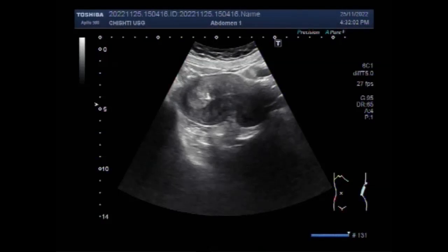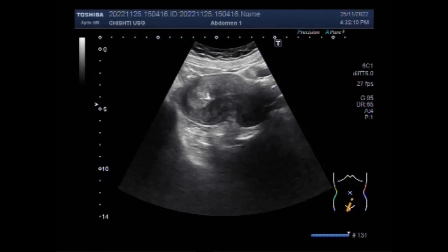Dear viewers, I hope you are all fine. This ultrasound video shows a case of uterine polyps, also known as endometrial polyps.